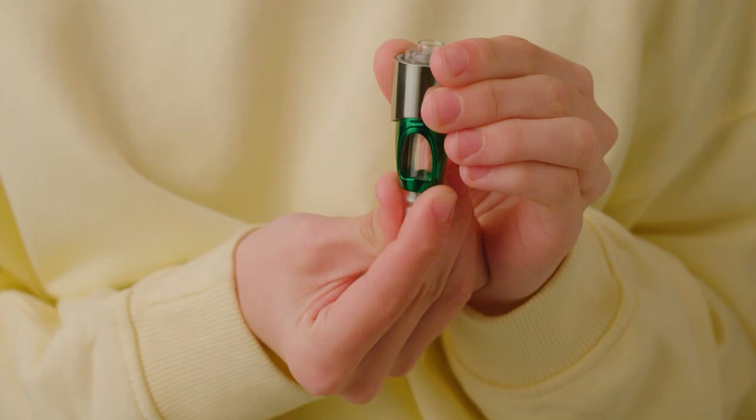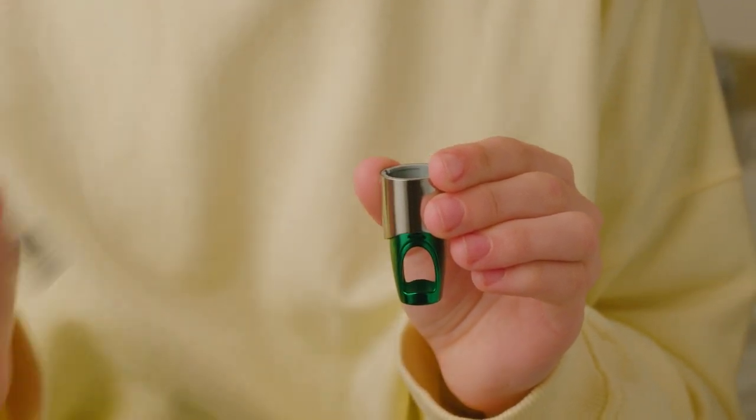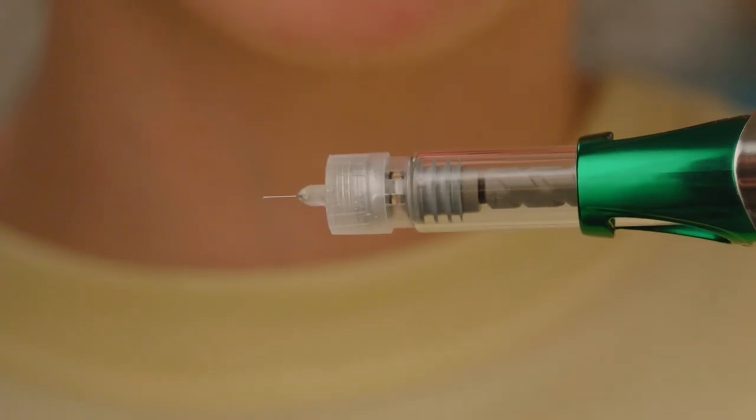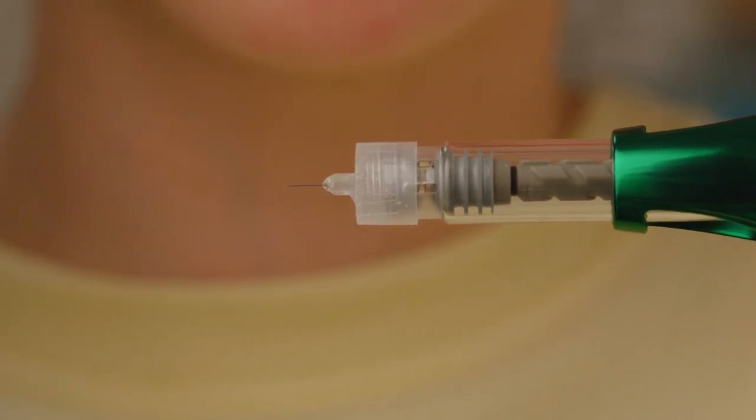When the cartridge is empty after a full injection, you'll need to exchange it for a new one. You'll know if your cartridge is empty after an injection if the grey stopper is at the far end of the cartridge, close to the needle.